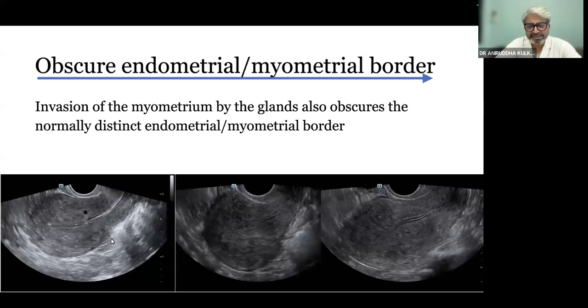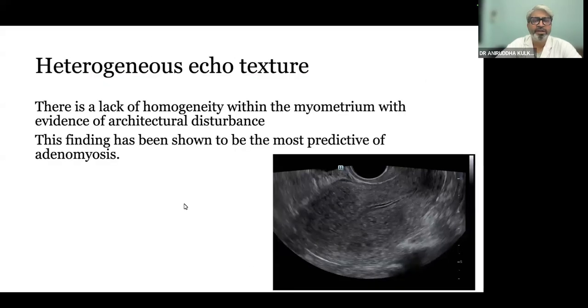Now, in all these three static images, you can see that I can make out the endometrial outline as a midline structure, but the triple line configuration is missing in all three. It can be seen in the lower part of the cavity in image 3. At the same time, the endomyometrial junction zone is quite indistinct and it is occupied by multiple hypoechoic and hyperechoic infiltrates in the adjoining anterior and posterior wall.